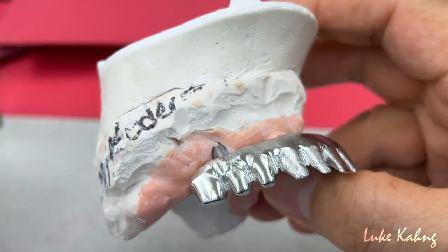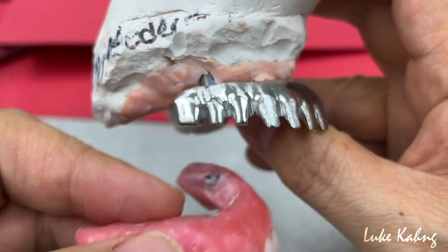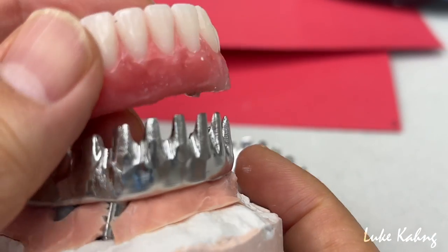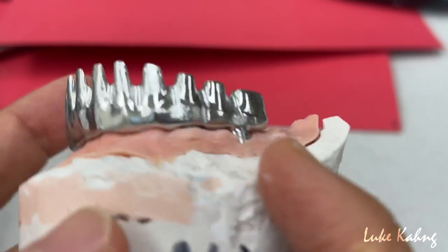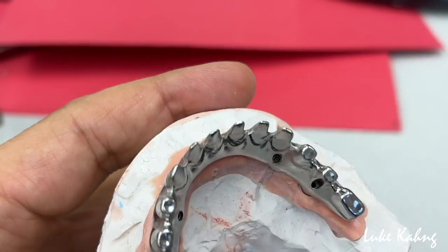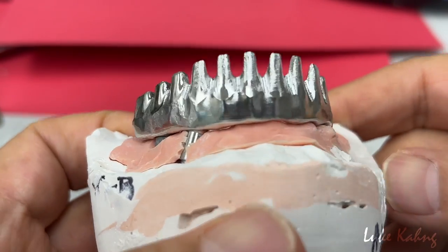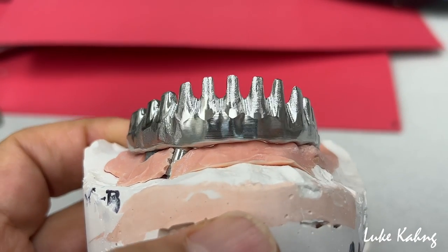That was the spider compared to here. We cut quite a bit of the lower. Okay. Right, so now we're trying to sandblast it and then the opaque. Then we design again for the final zirconia of the single anteriors and posterior bridge.